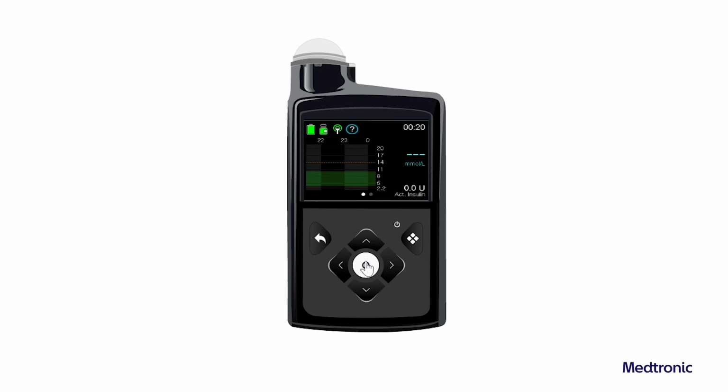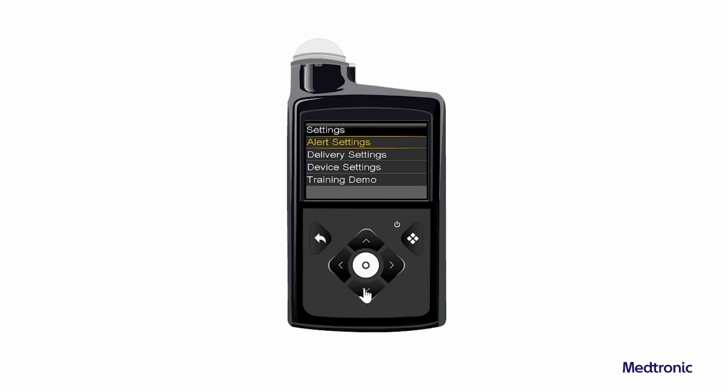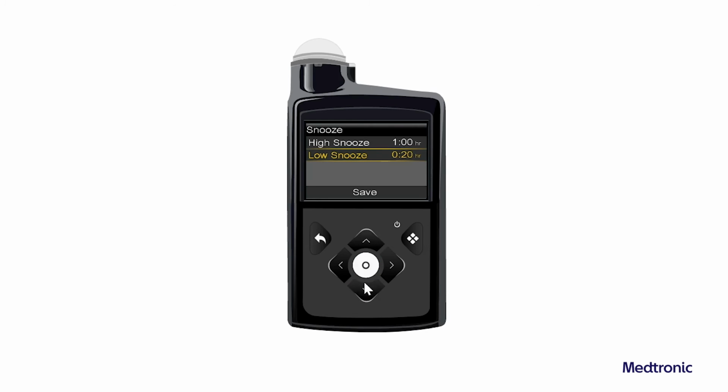To set the low snooze, from the home screen, press Select, and then select Settings. Select Alert Settings, and then select Snooze High and Low. The snooze screen appears. Select Low Snooze and enter a time in 5-minute increments from 5 minutes to 1 hour. Select Save.